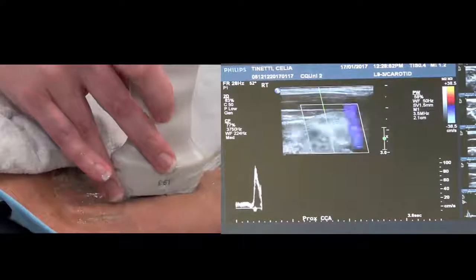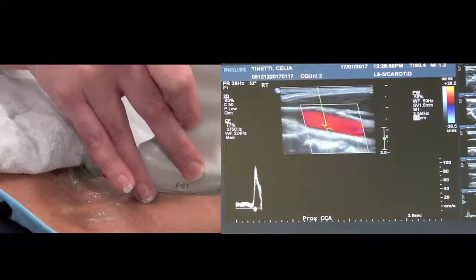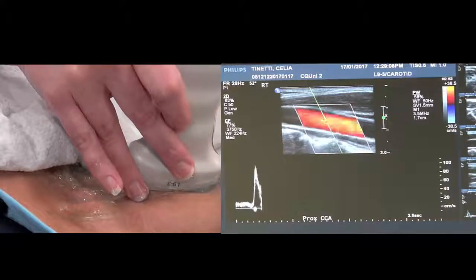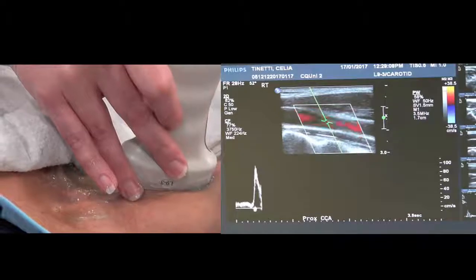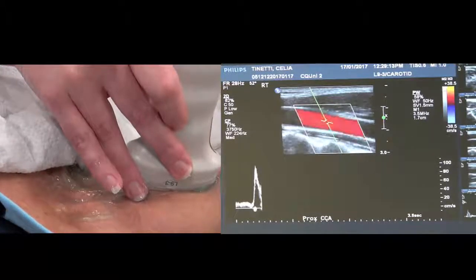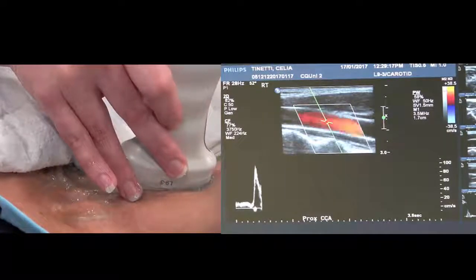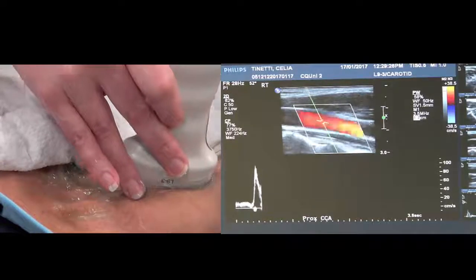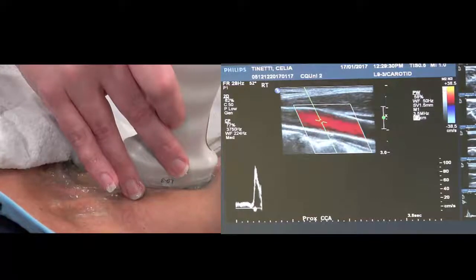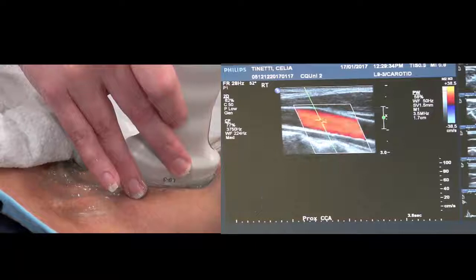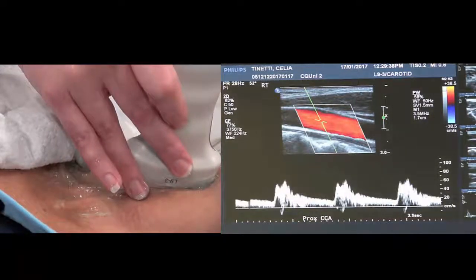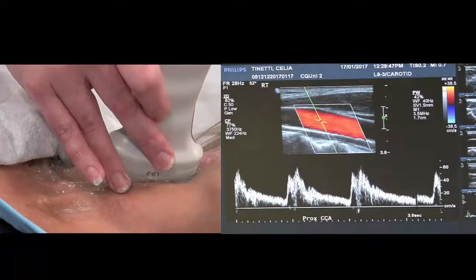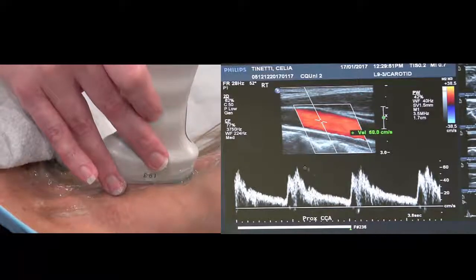Update again, we're sliding up the neck now, getting to the bulb area. You're going to steer — not in the bulb, please go just outside the bulb. On the touch screen it's got the 2D tab. Sometimes the focal zone is dictated by where the trace is coming from and you can't actually adjust it — just be aware of that. Now that's a little bit bright and the scale's a bit big, so I'm putting the scale down and putting the gain down a bit. That's a nice clear trace because you've got a lovely window there.